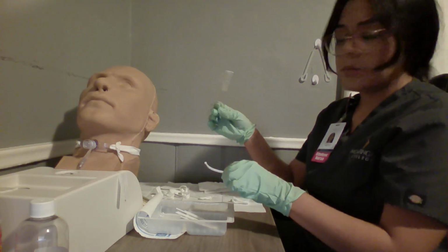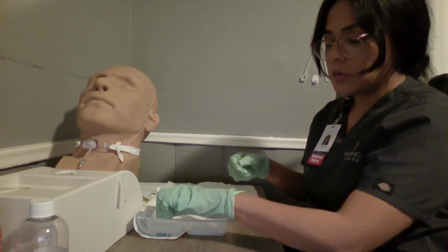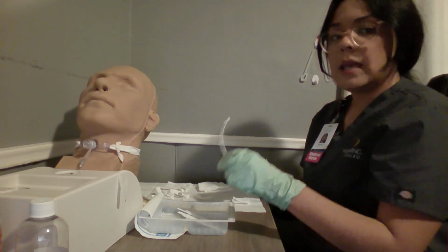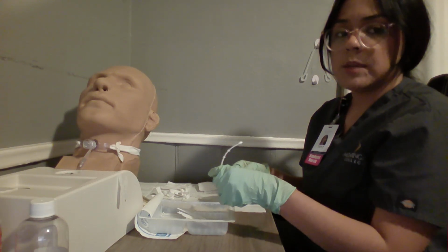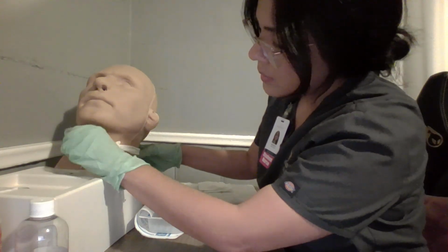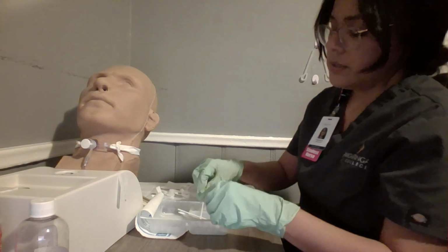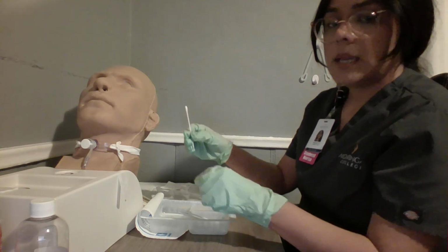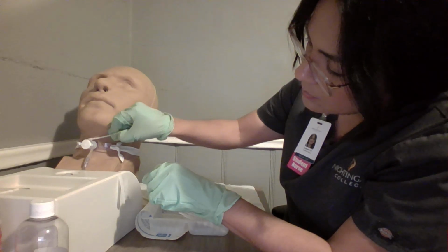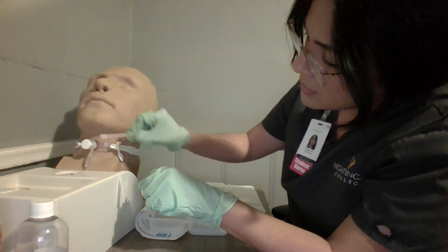I will throw away this brush. I will rinse the inner cannula and I will place it back into the normal saline. I will let that soak. I will pull it out. I will let it dry and I will place it back into the tray using my patient's curvature, and I will lock it back into place. Next, I will clean the skin and around the flanges. I will take a sterile applicator, Q-tip. I will clean around the incision.